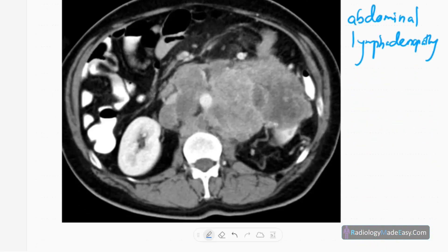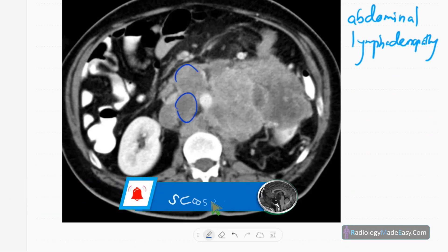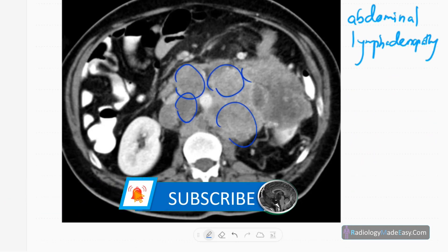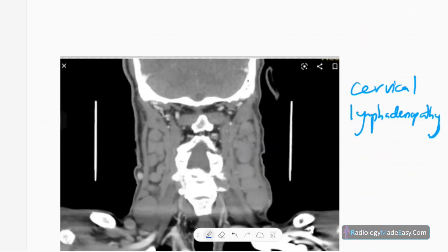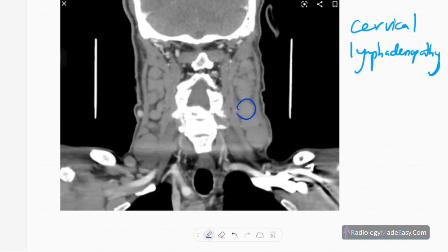On contrast CT of the abdomen, you can see multiple masses in the retroperitoneum — these are multiple enlarged para-aortic lymph nodes that are enhancing, with some showing necrosis. The aorta is also compressed due to the mass effect. This is abdominal lymphoma in the para-aortic region.